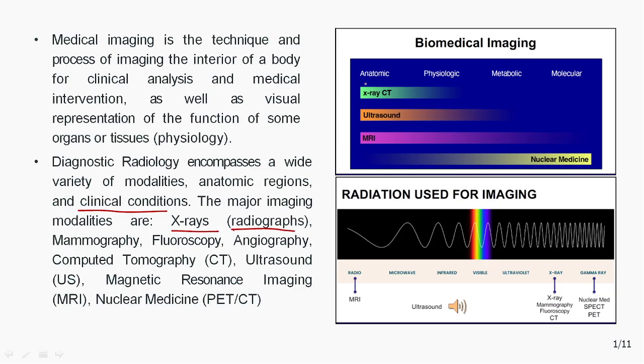This technology uses X-rays as the energy source for imaging. It also includes mammography, fluoroscopy, angiography and computed tomography, where X-ray is used as the source of energy.